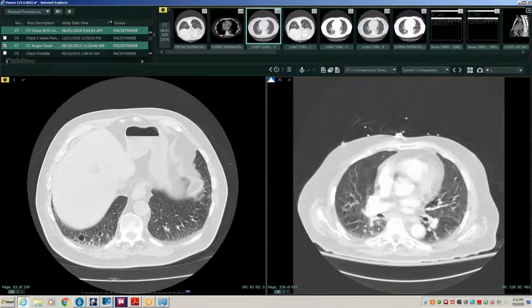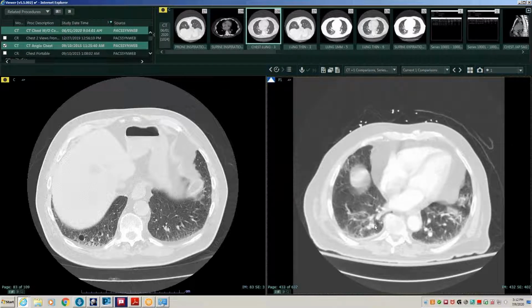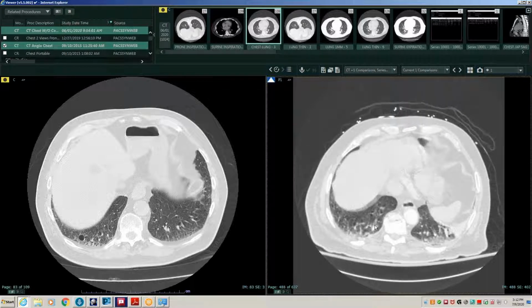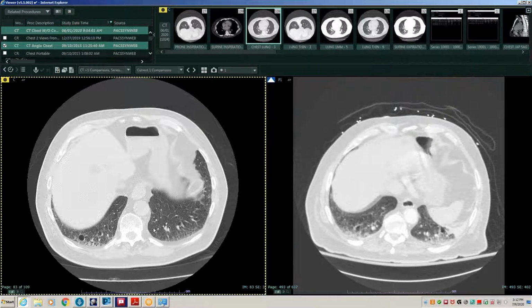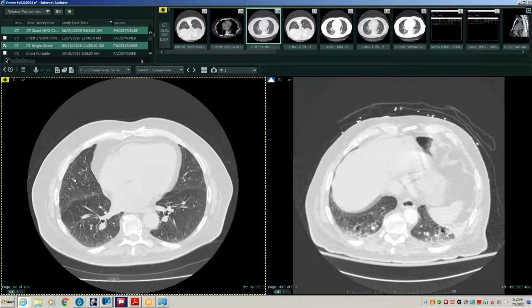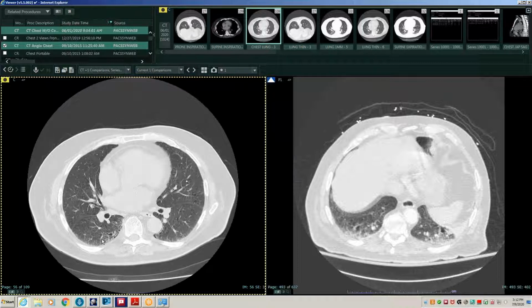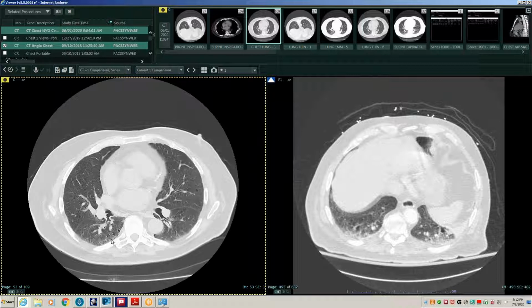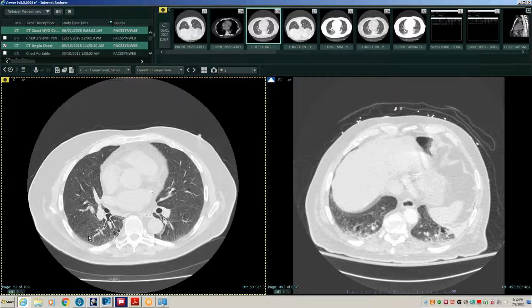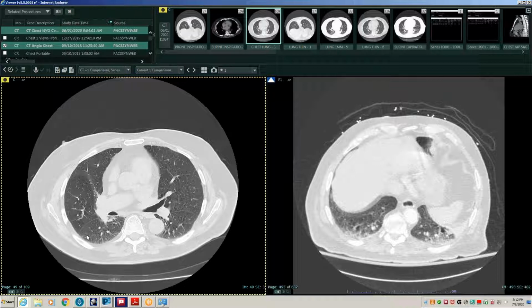You can see them sometimes, and you don't even have to have cysts. But I've also seen in Sjögren's patients with LIP that they get what looks like NSIP fibrosis mixed in. But I think most of what you're showing, if you go up top, looks much more like smoking-related lung disease, where you get these little holes confined to areas of ground glass opacity. Yeah, and it's more upper zone predominant. There's a few cysts in there, but yeah. And I think that's a collision of fibrosis and emphysema, and the ground glass is a bunch of inflammatory cells and fibrosis. Don't you agree, Seth?